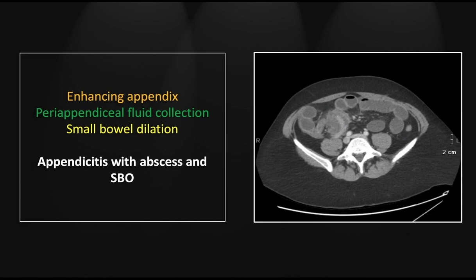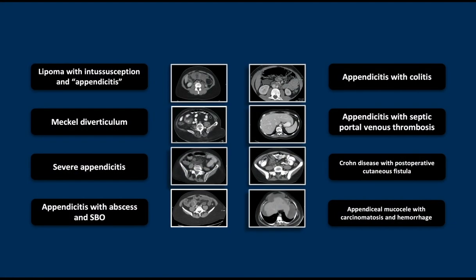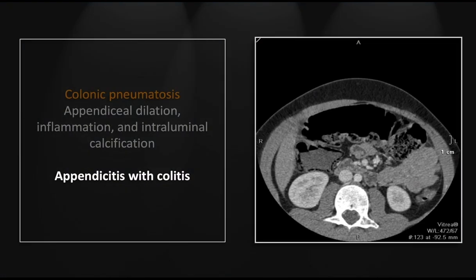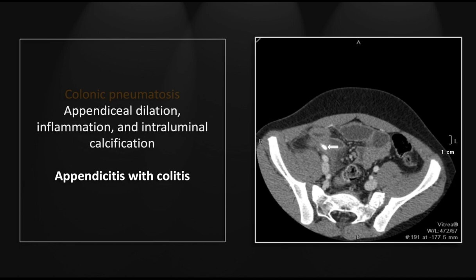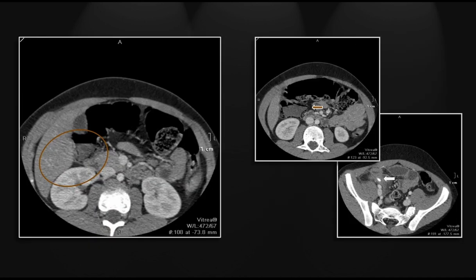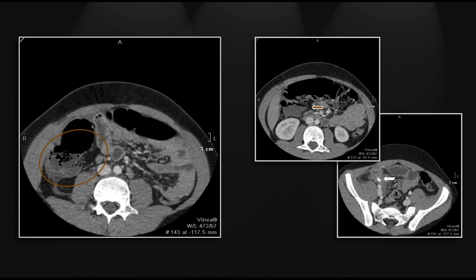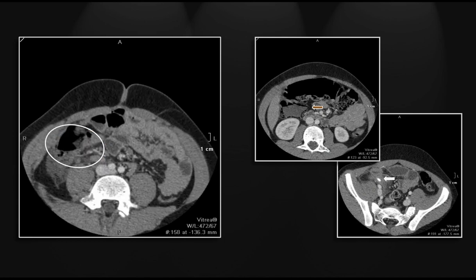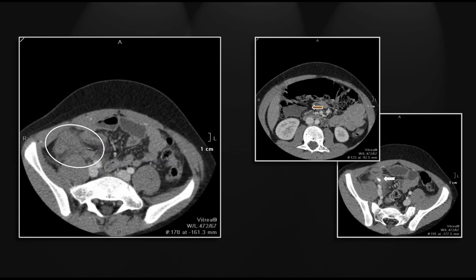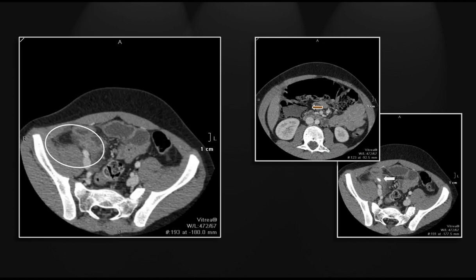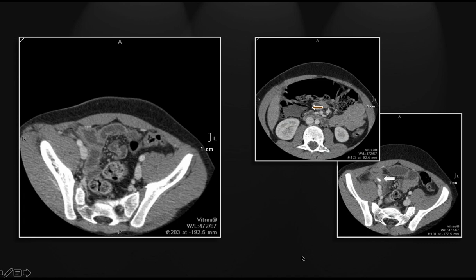Our next case is a severe appendicitis with associated colitis, manifesting as colonic pneumatosis throughout the ascending colon. There is also a dilated appendix with wall thickening, stranding, and an intraluminal appendicolith to effectively confirm the diagnosis of primary appendicitis. Here is the pneumatosis throughout the ascending colon, and inferior to the cecum, you'll see the dilated thick-walled appendix with the associated appendicolith. That is appendicitis with ascending colitis.